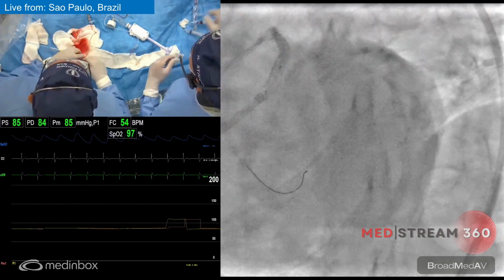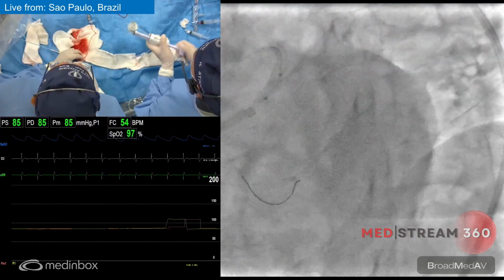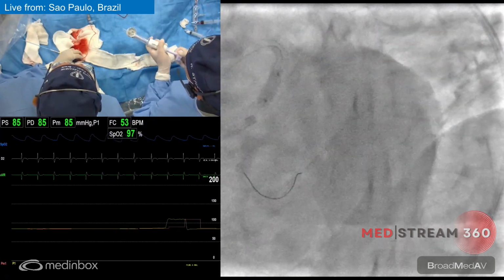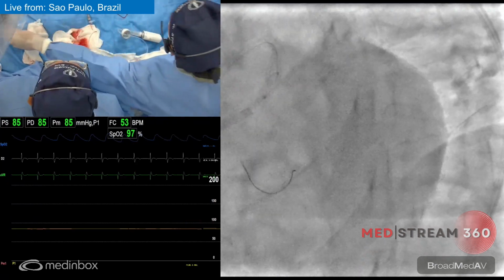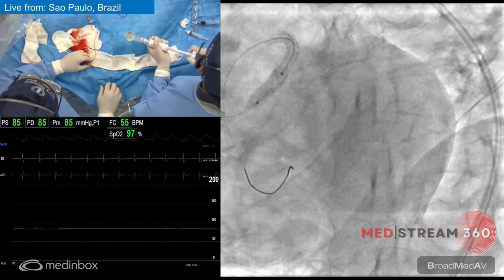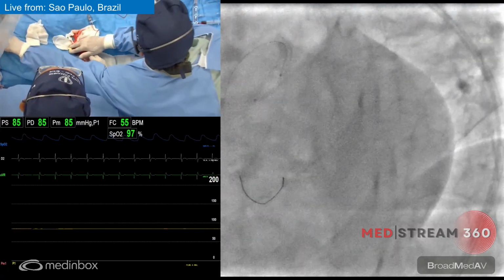So you went to the low pressure, and then now just make sure you're in the right position. Okay, now you can go high pressure. And then you can do the flaring, right, to the ostium. Yeah. You pull more, and you pull back the guiding catheter to have the flaring. Yeah. That's what you should do.